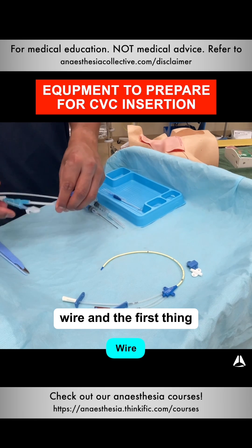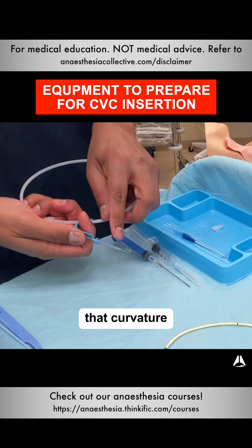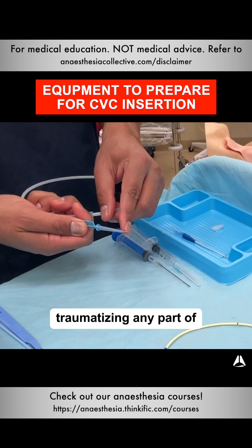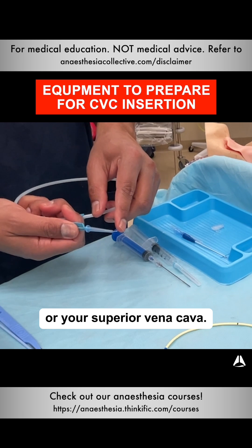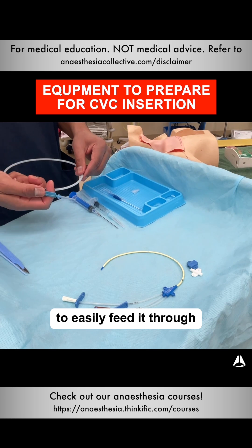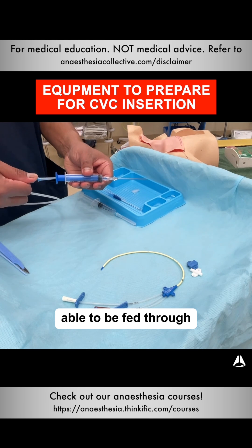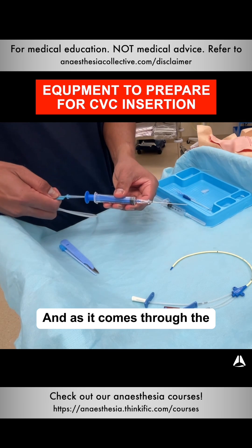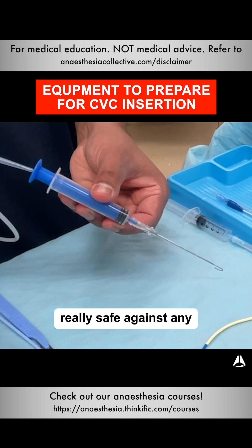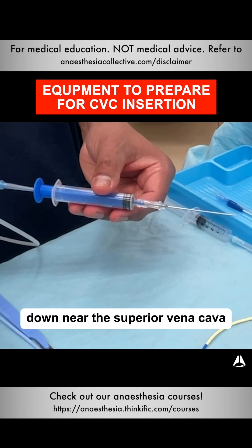I've got my wire and the first thing I do here is set it up. I take this off and see that it's got a curvature. That curvature is to stop this tip here from traumatizing any part of your central vein, your internal jugular vein, or your superior vena cava. I just prep that so I'm able to easily feed it through my syringe and needle. As it comes through the other side of the needle, it flips over into a bit of a horseshoe, which means it's really safe and not going to traumatize the wall when it's down near the superior vena cava or the right atrium.